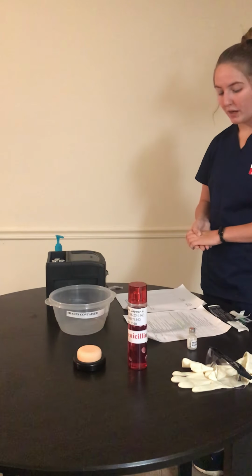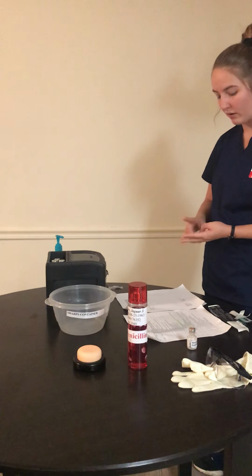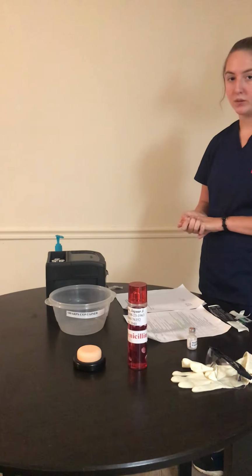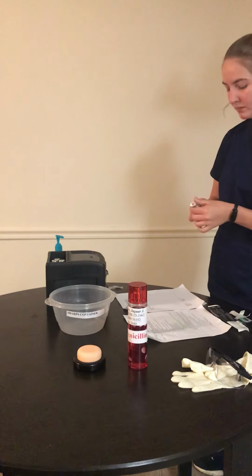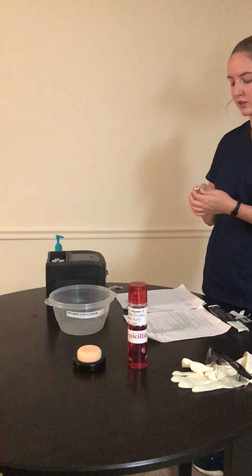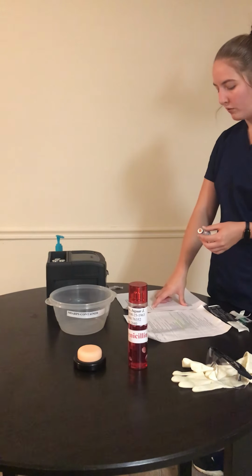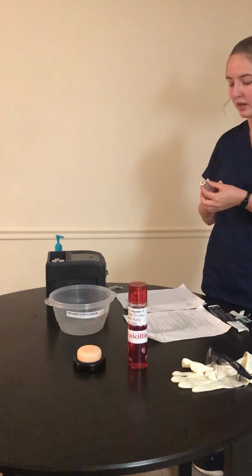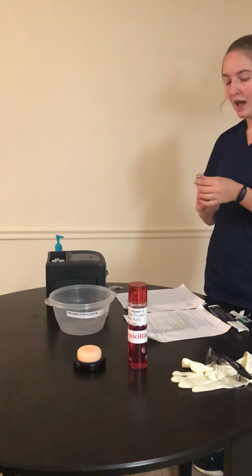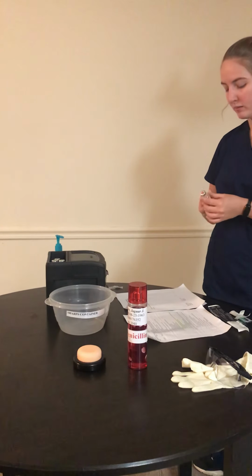So now that I have my right patient, right medication, right route, and right time, I'm going to do the right dose. First, I need to calculate the correct dosage. So this is morphine sulfate, 10 milligrams per milliliter, and I need morphine sulfate 5 milligrams. That means that I'm going to withdraw half a milliliter of solution to have 5 milligrams.